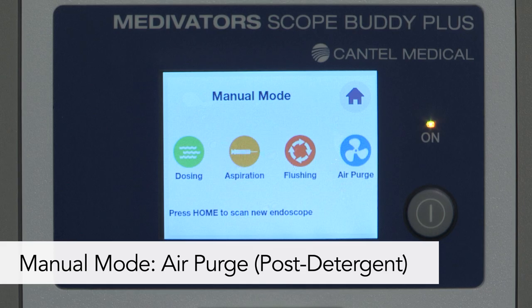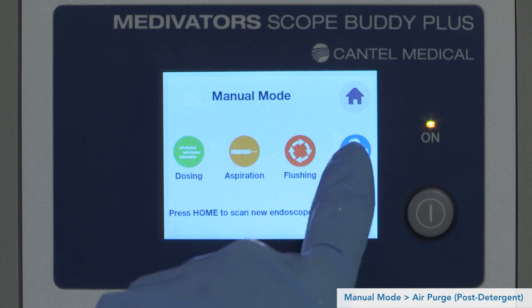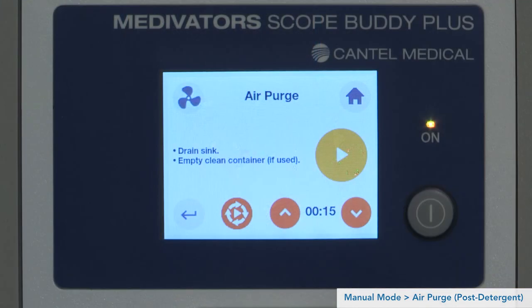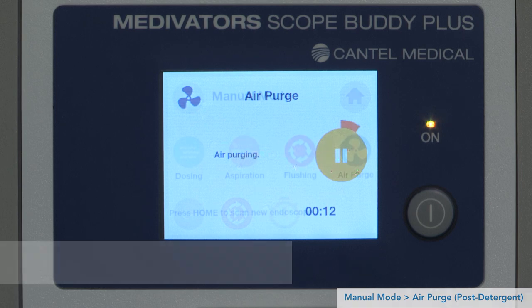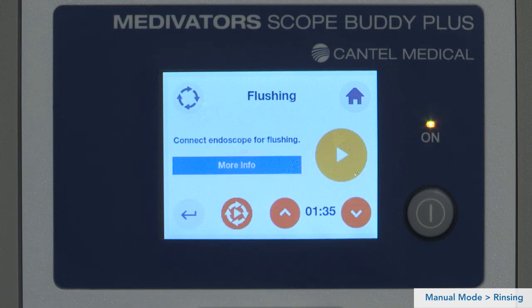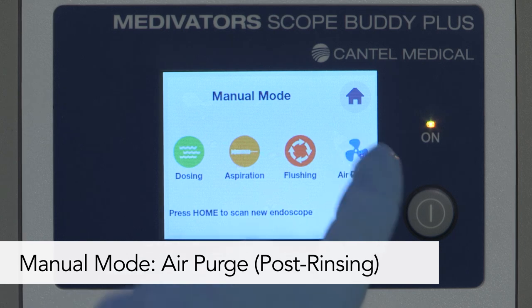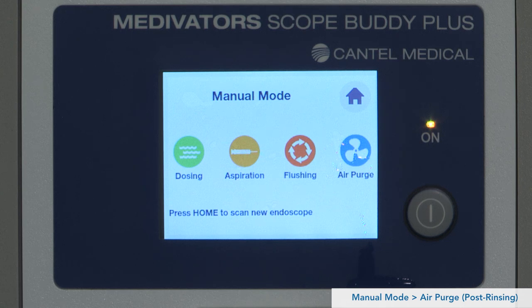Use the air purge step to circulate air through the endoscope to expel detergent solution. Select the Air Purge icon from the manual mode screen. Lift the strainer on the pump tube out of the sink or clean container and drain the sink. The default air purge time is 15 seconds; press play to begin. Now it is time to rinse the endoscope with clean water; use the Flushing icon again to pump clean water through the endoscope channels. Use the air purge step a second time to circulate air through the endoscope to expel rinse water. This completes the process using manual mode.